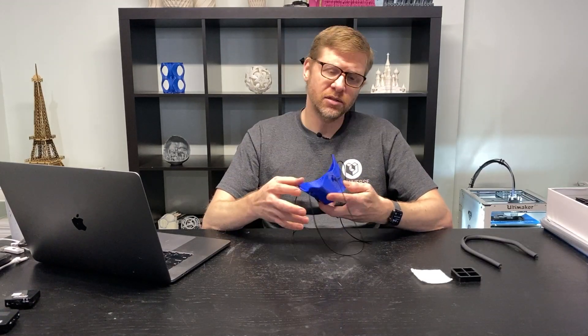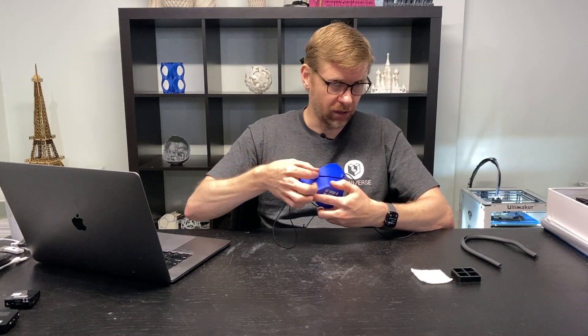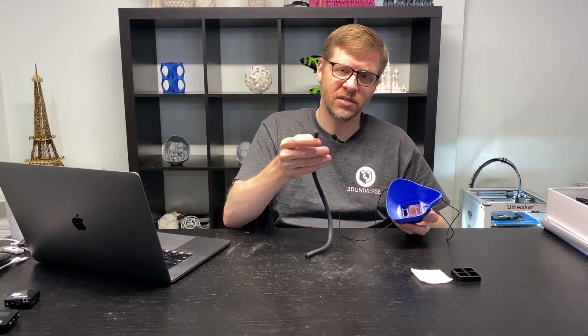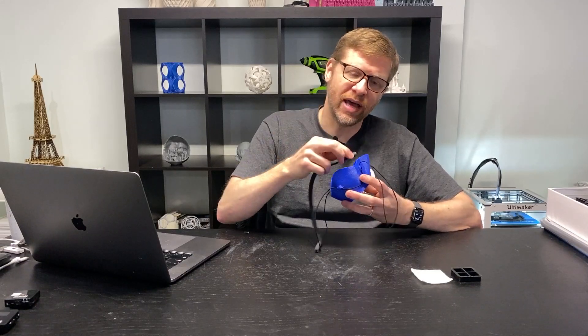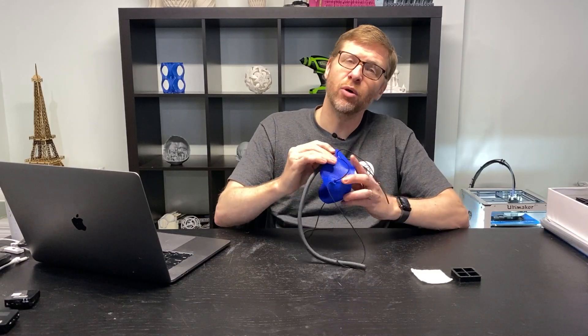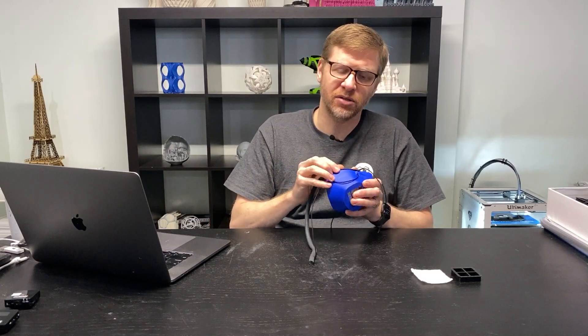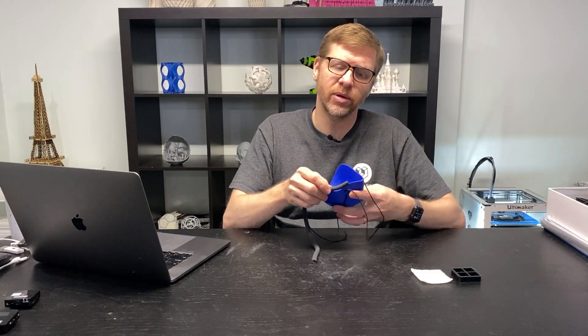Another change is the strap connection points — we moved those down a little bit because that allowed room for those who wish to add the gasket mechanism on the outside. Since we're using a C-channel gasket that comes down over both sides, we wanted to allow room for that gasket material when it is being used. So we moved those connection points down a little bit to allow for that.